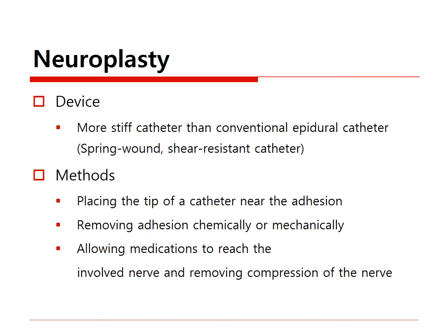For neuroplasty, a specially designed catheter is used. Usually, the catheter is more stiff than a conventional epidural catheter. This special catheter is a spring-wound and shear-resistant catheter.